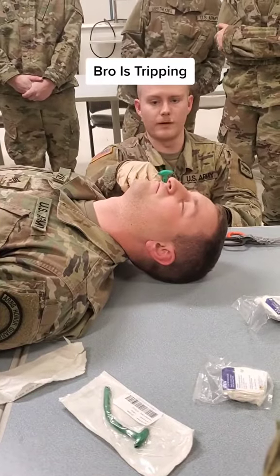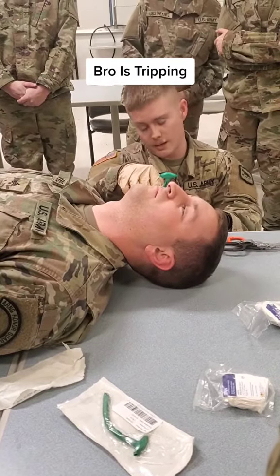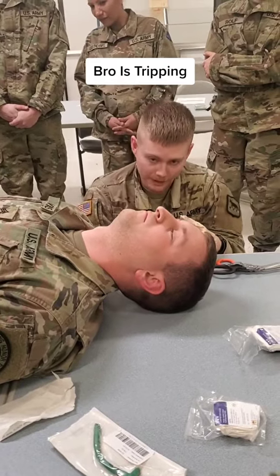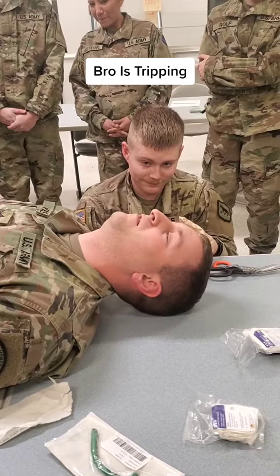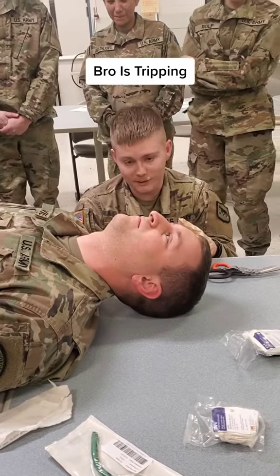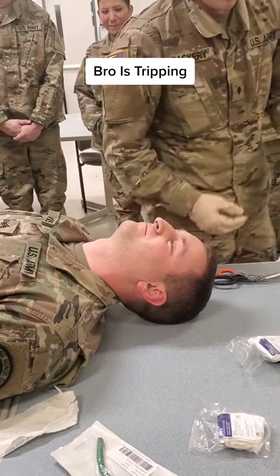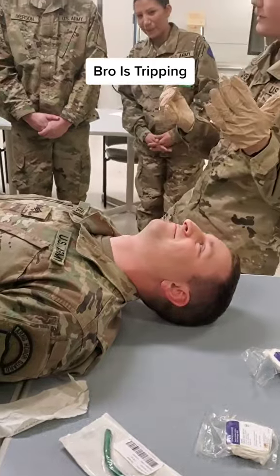If I put it all the way in, it's just gonna be slightly beyond. Would you like me to trim it? You're the medic — it's not gonna make a difference. It just might suck for you because you're conscious. Yeah, trim it.